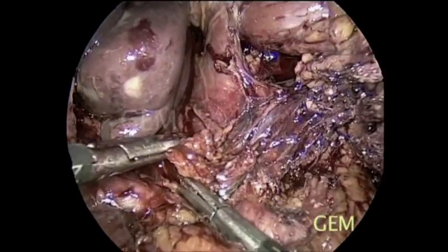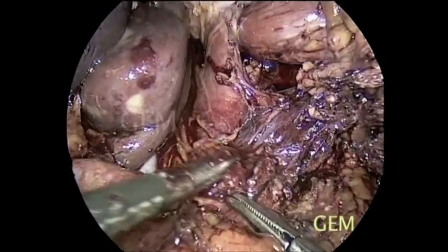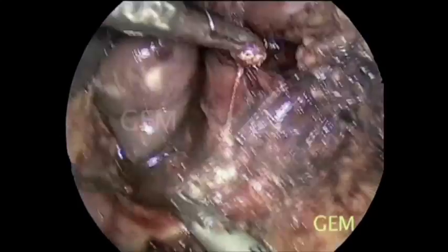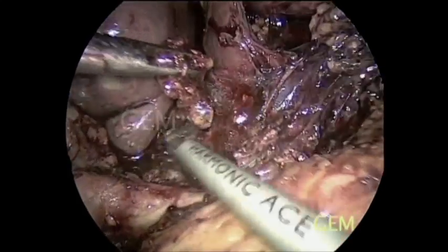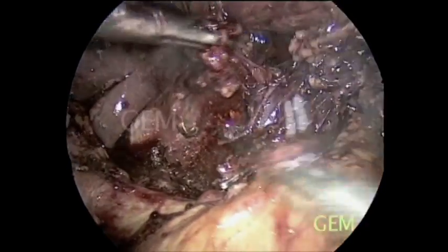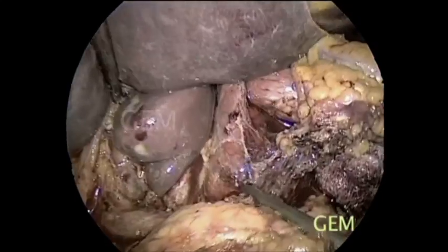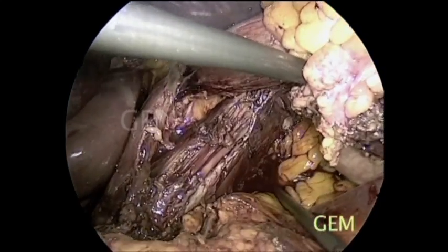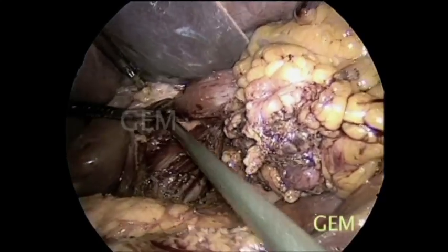We take the nodes lateral to the celiac axis, clearing completely the right crus between the portal vein as well as the celiac axis. This is the IVC here. We have taken part of the right and left crus muscle as part of this specimen.